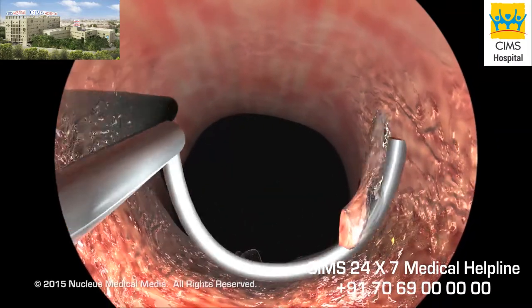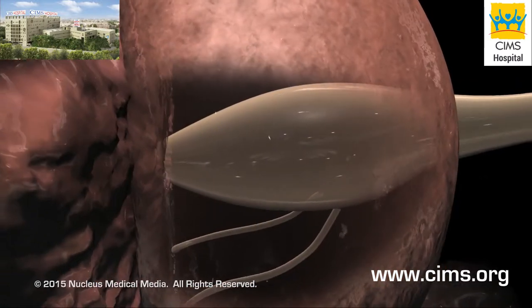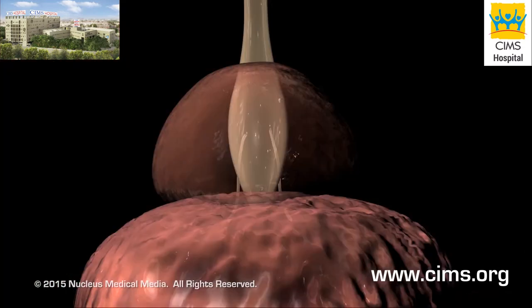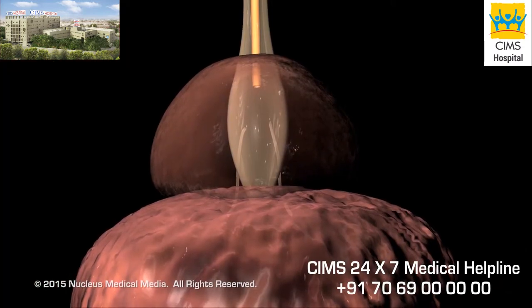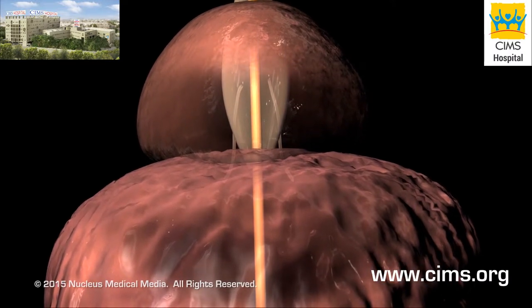These bits will be washed into the bladder and out through a special port in the cystoscope. When an optimal amount of prostate tissue has been excised, your surgeon will remove the cystoscope and place a catheter into your bladder to keep it draining for up to two days after the surgery.